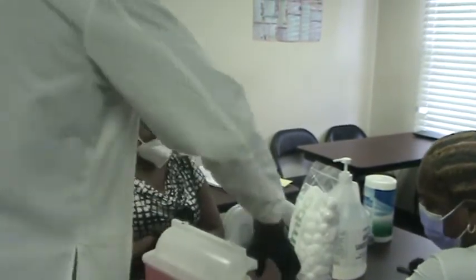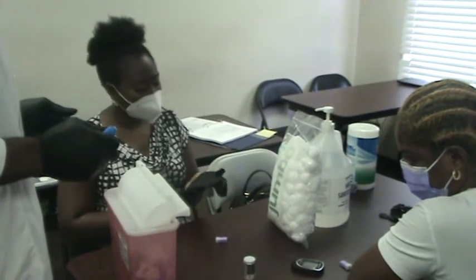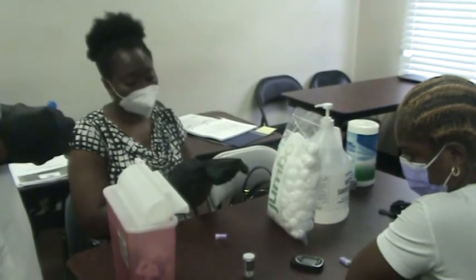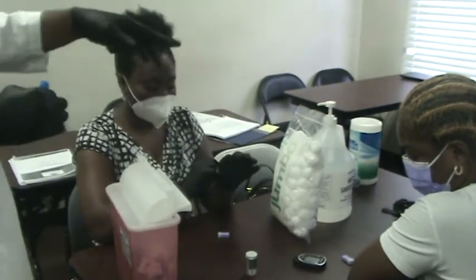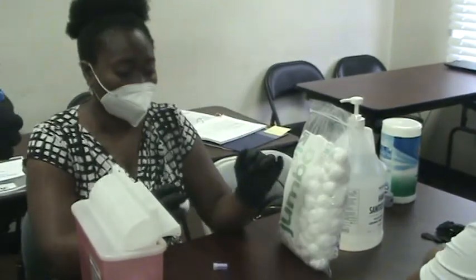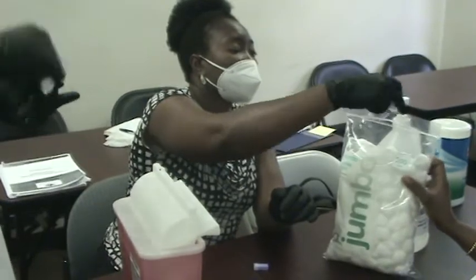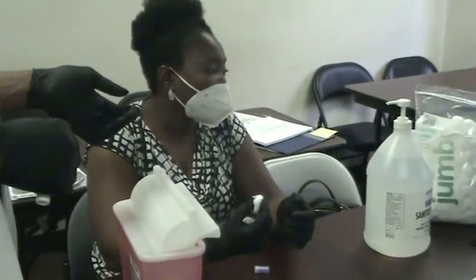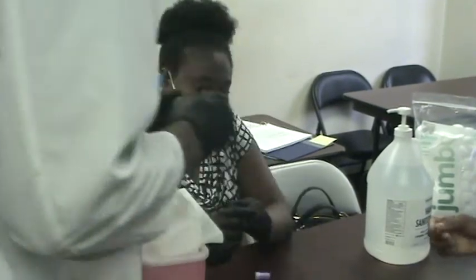Alright. So you need, you take it. You will need two cotton balls. One to wipe the first time, and one to wipe afterwards. So take the strip out.